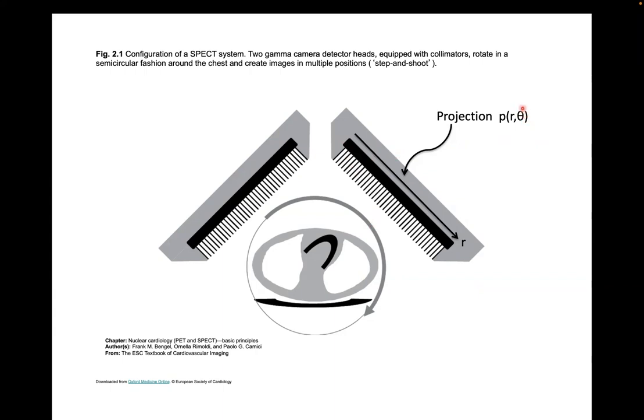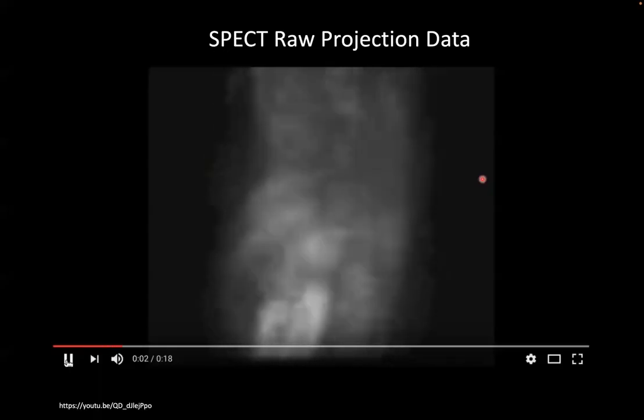We're going to click through a set of thetas. We'll take this whole system and click it, say, by 1 degree, theta changes, and then we get a new P(R, theta) function. So mathematically, that's how you want to store your data.